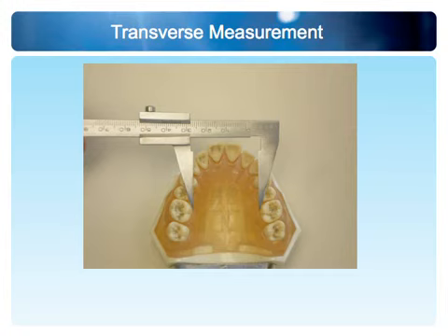33 is not a crime, but every now and then people walk in with 30, 28, 27, 25. Very narrow V-shaped arches, or even the omega-shaped because it squeezes upper first molars in a little more. And we're going to look at those in a few minutes. But what we do with the Boley gauge is we measure it on every patient. And if you have study models, you can just measure the model.